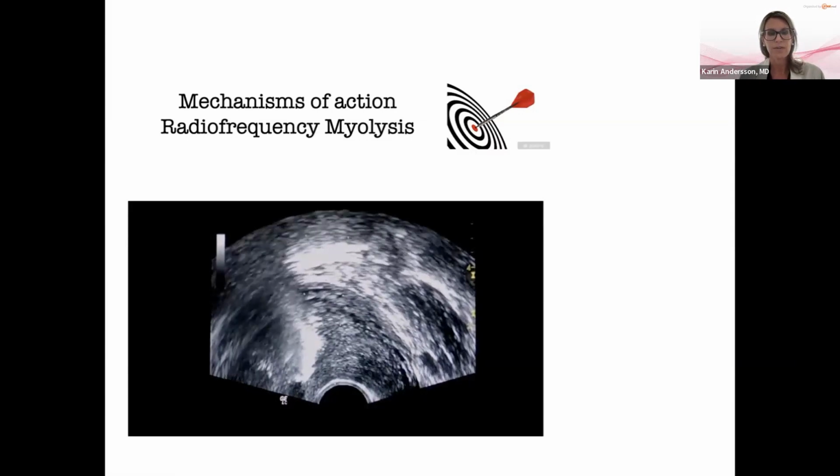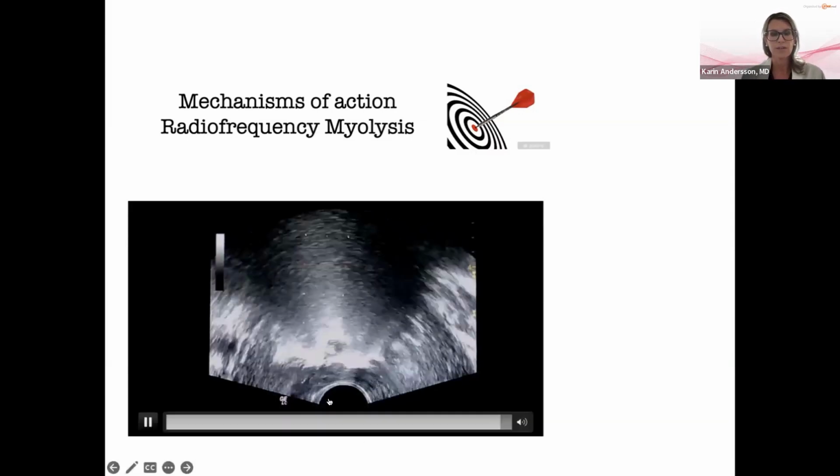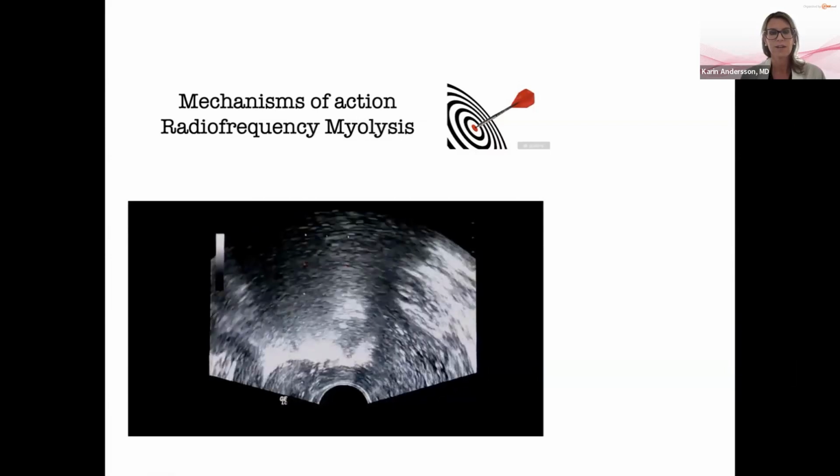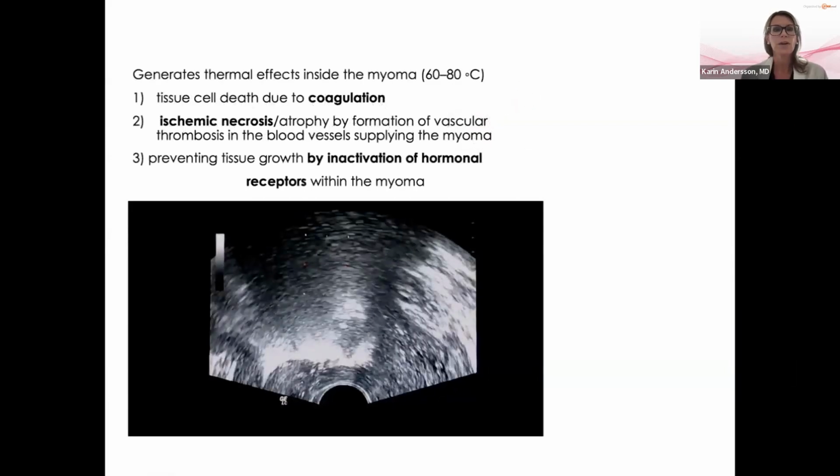So after the procedure is done, you can see this kind of image. What's happening is that we generate thermal heat in the myoma, about 60 to 80 degrees, and we create tissue and cell death due to coagulation, and ischemic necrosis with atrophy by the formation of vascular thrombosis in the vessels supplying the myoma, which means that with time it will shrink.